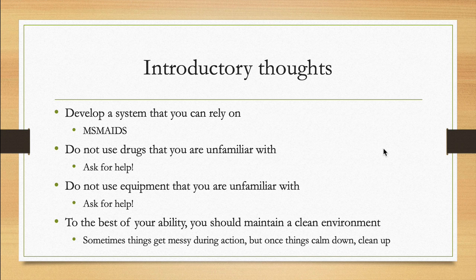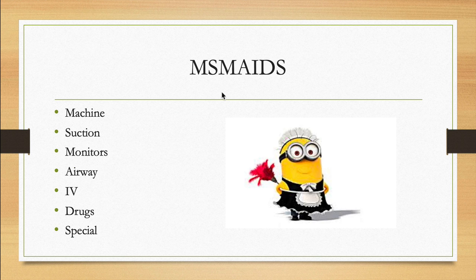Now sometimes things are going to get a little hairy in the OR: bleeding, cardiac arrest, all sorts of catastrophes can go down where it becomes a giant mess, but once things calm down, always take a moment and clean up your workspace. So what does MSMAIDS stand for? It's an acronym to help remind us of all the things necessary for a complete room setup. The first of which would be machine, then suction, monitors, airway, IV, drugs, and special. And we're going to go over each one of these things in great detail momentarily.